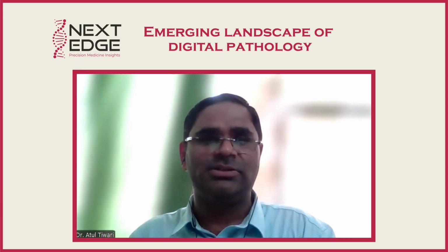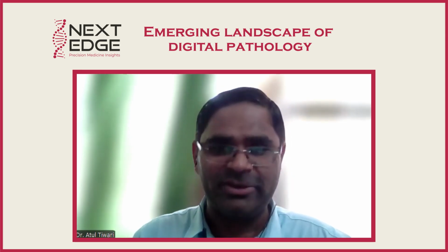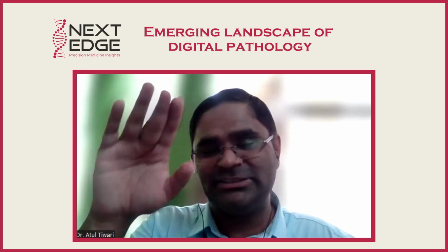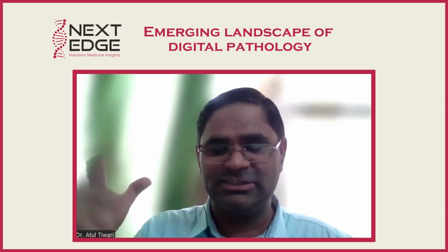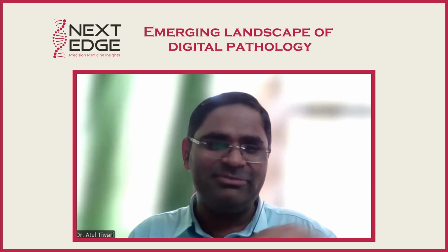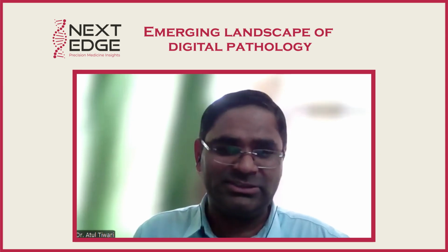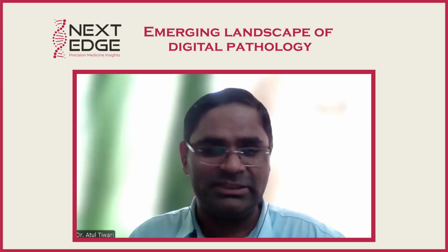Just for example, if there is an H. pylori case, a GI endoscopic biopsy, and I decrease the brightness and decrease the contrast, H. pylori, which are already so tiny, will get lost in this increase and decrease game. So one should understand that much of technical details.